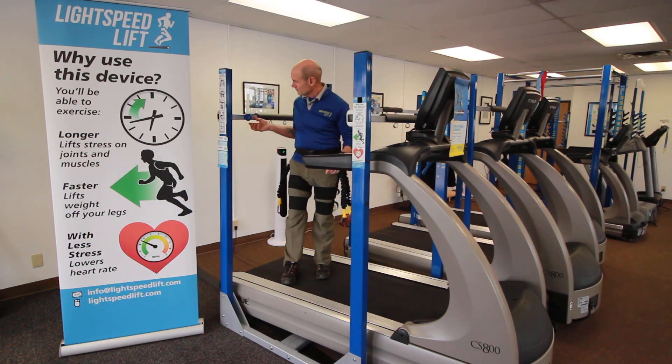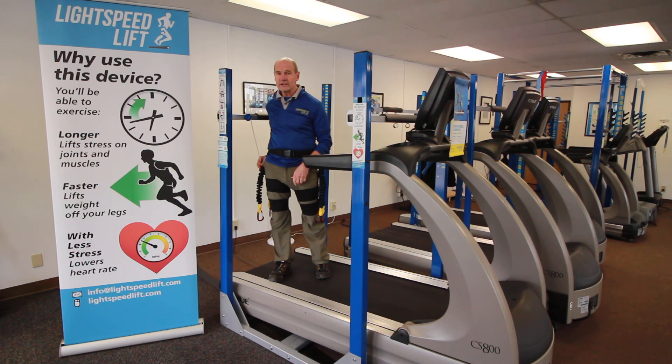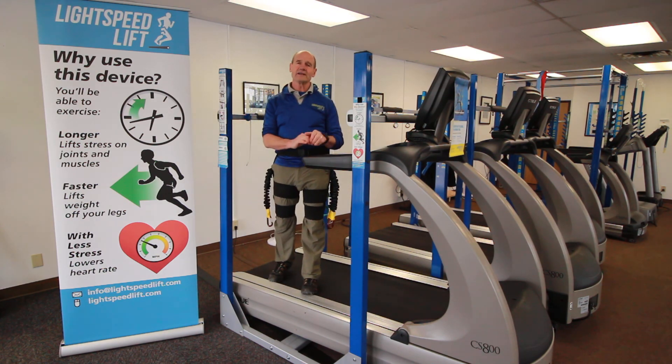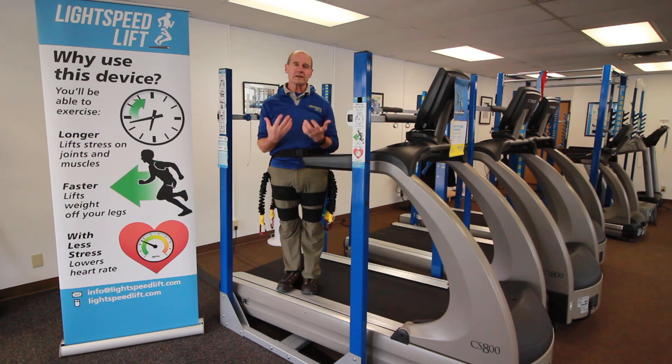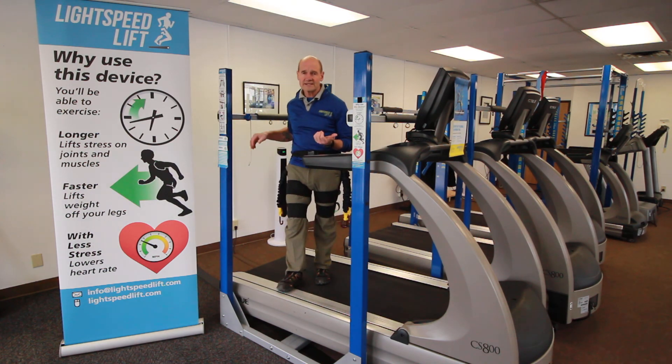Now I'm ready to go. I measure down 12 inches to my hip. I chose 12 inches because that gives 25 pounds of lift, and clinically over the years that's been an effective amount to use as a starting point.